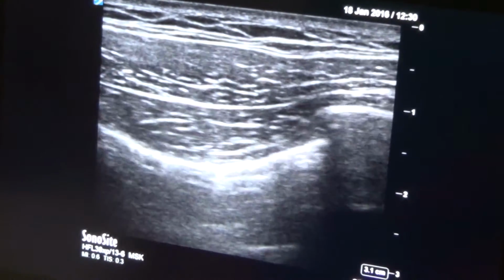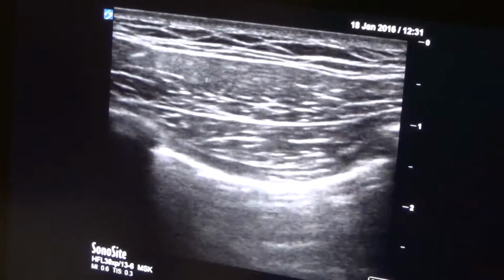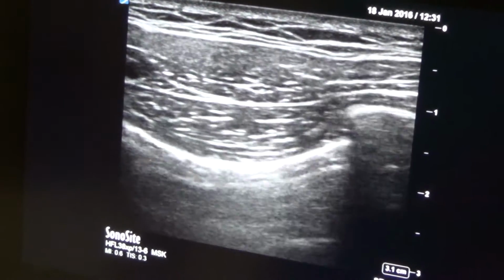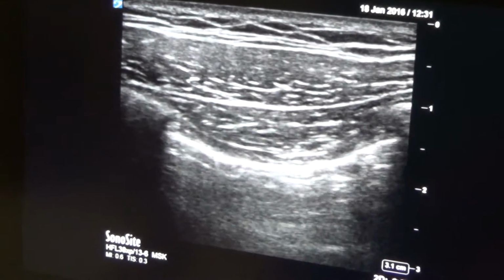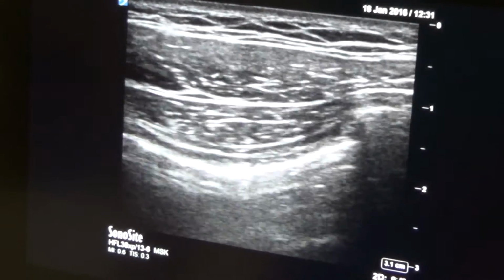Can you take a deep breath, Julius? Okay, you can see how clearly the sliding. Take a small breath. You see, this is the lung sliding. This is one rib, that is another rib. In between, what you are seeing is the external or internal intercostal muscle.